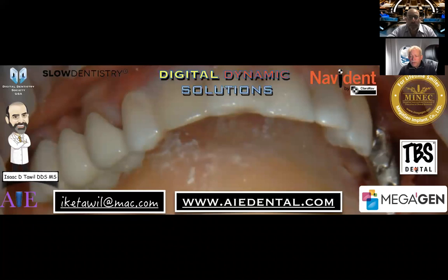And you very nicely showed that this is not just a procedure for anterior maxillary incisor cases. It's one that can be used to preserve. It's not just about preserving the buccal bundle bone, that area where we normally see resorption, but as you showed in the molar area, it's also about the volumetric changes that can occur when you have an extraction and you don't graft, or you have an extraction and then you place an implant without grafting.